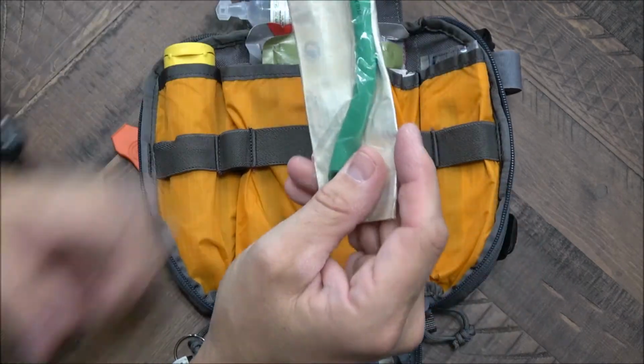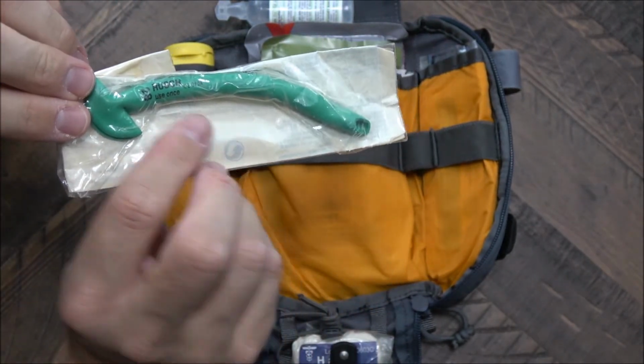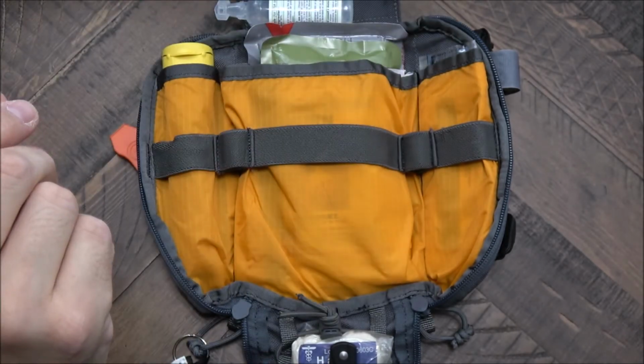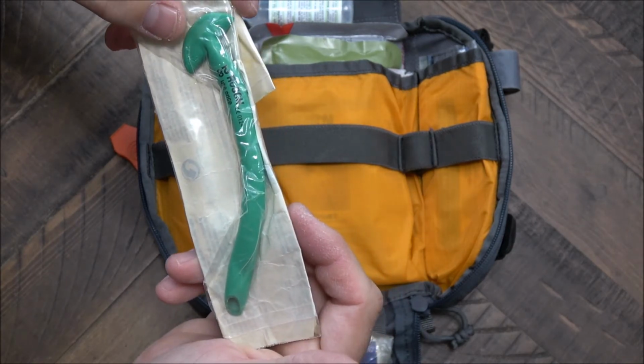Here I've got a nasal pharyngeal tube. This is just to secure airway in a patient. So these are important, and if you've never had one of these put in, they are a little uncomfortable.